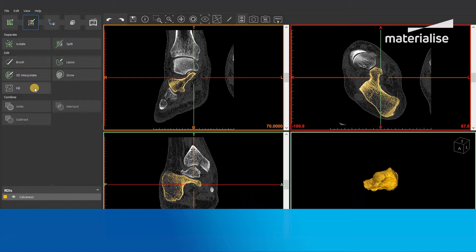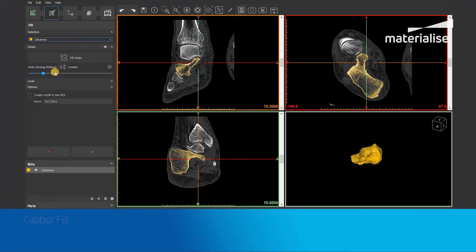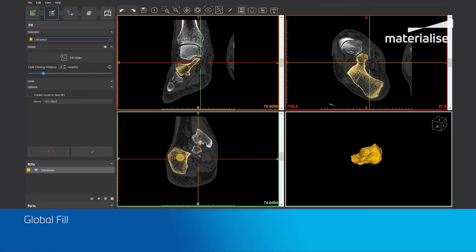Now let's try it out on the Calcaneus demo dataset of Mimics Inprint. Open the fill tool and select a region of interest that you want to fill up. If you have a region of interest with multiple islands, first split the region of interest to better fill up the separate regions. In this case I will select the Calcaneus region of interest. As you can see, it has a lot of holes and missing information.